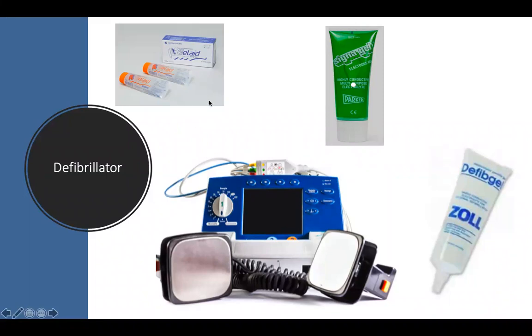Then the defibrillators, according to the specifications, they need to be checked on a daily basis. And after you've checked your defibrillator, there is a printout that comes out. So most of the nurses have been trained to check the defibrillators.